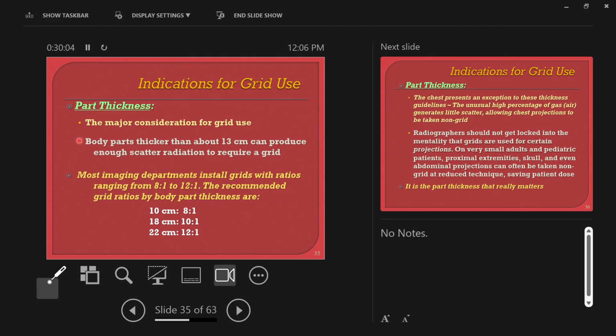If you don't know how thick a body part is, how can you figure it out? Measure. But with what? Use a caliper. So measure it with a caliper. As you guys are practicing and you're first getting out there, make sure your x-ray techs show you where the calipers are. Make sure that you have used them. I know x-ray techs get in this habit of just eyeballing things because they go, I just know what it is. You don't until you develop the skill for it. So use calipers until you're ready to do this. And they really, honestly, should be using calipers all the time. We just tend to not.